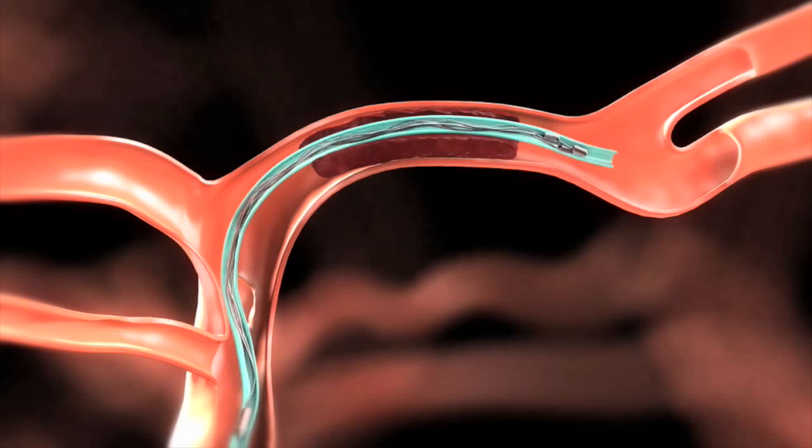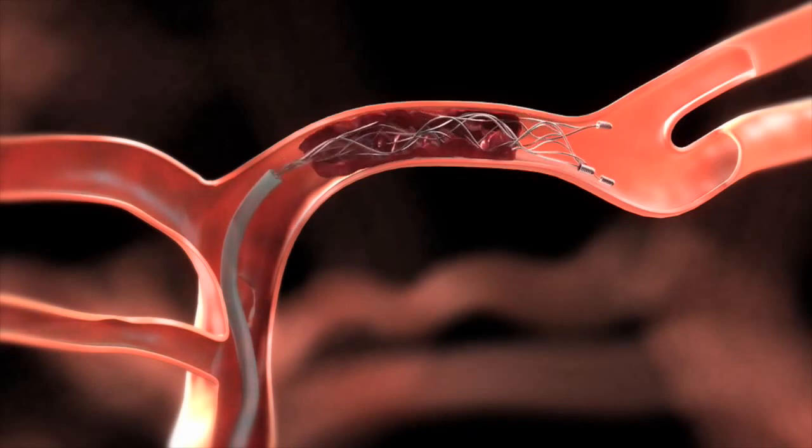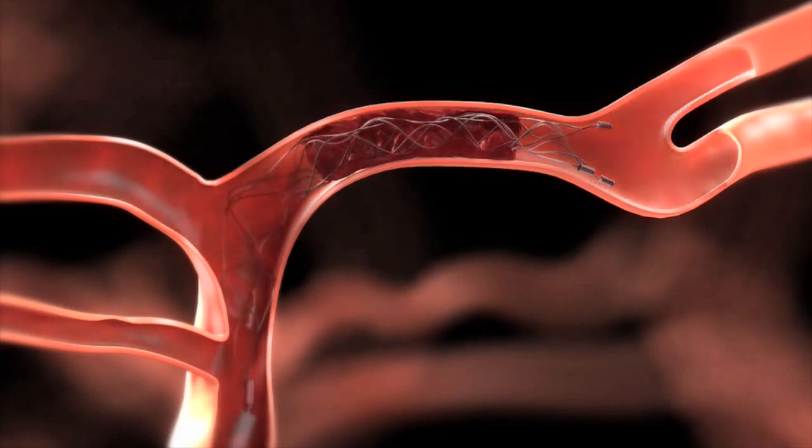Once we're across the blockage, we bring up a mechanical thrombectomy device, which is kind of a stent on a stick kind of configuration. It's a stent-like device that we unsheath within the clot in the blockage. You can see the stent is opening up and actually restoring blood flow immediately. We then give it about 5 minutes, allowing the radial force of the stent to open up outward and allowing the clot to extrude within the lumen or inside of the stent.